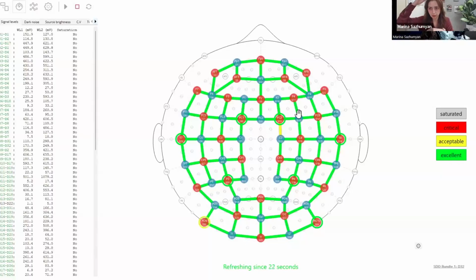So we do advise doing this 90-degree movement of the spring tops. In some cases, you may want to change your spring tops to a higher intensity. So here we have spring tops varying from 1 to 3 with zeros in the front, in the prefrontal area. So this is what I'm doing right now, moving the spring tops, and already the signal is improved.